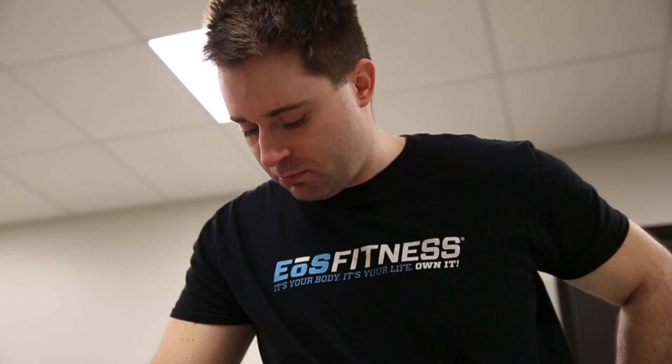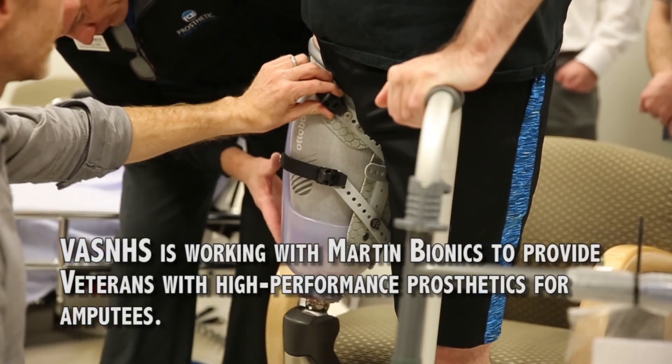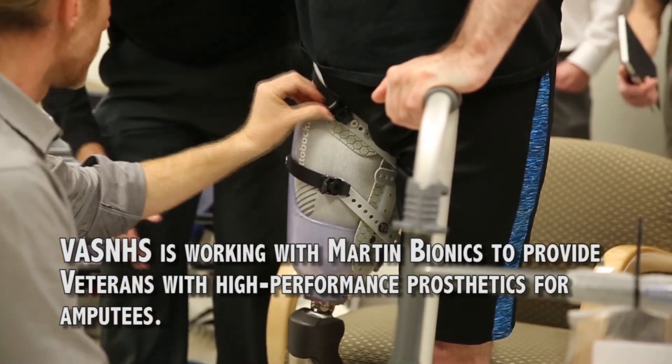So if it looks like it should, then it's probably right. If it doesn't, then that's when you know it needs to be changed. Actually looks pretty good so far.